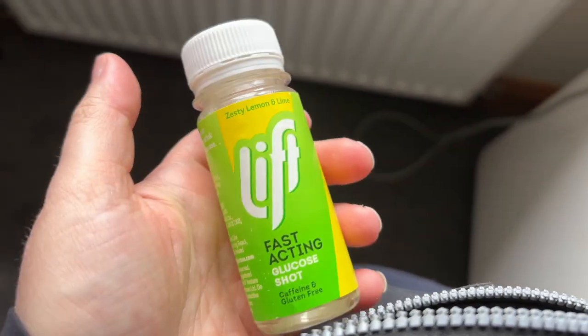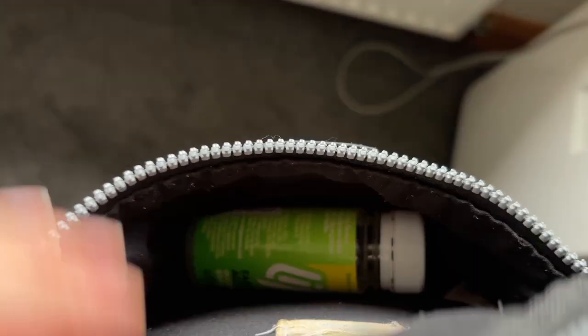I feel a bit unfit because I haven't been running in about three months, so I'm trying to get back into it. I'm really a bit nervous about running with the pump and how that will work out. I'll give you an update on my blood sugar before I start running. I have a little bag for my phone and I'm going to bring a lift because you never know what could happen.